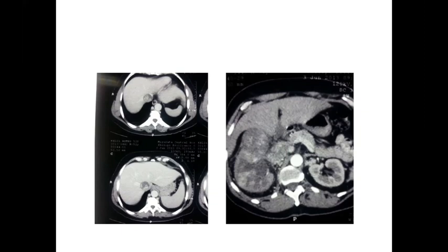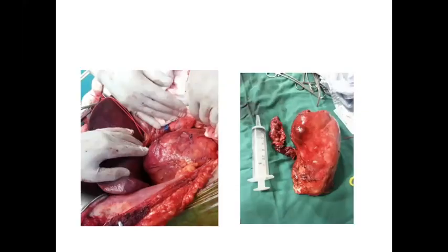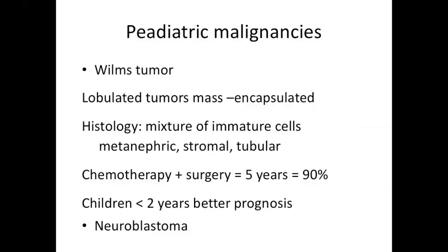And the supradiaphragmatic IVC control I found extremely helpful in preventing embolization to the heart, because these can easily embolize and they get you into trouble with the patient, obviously systemic condition. That's what we've done in this case, and you can see that the tumor is removed with the thrombus invading all the way to the diaphragm.